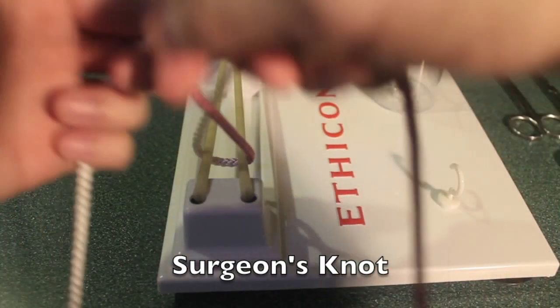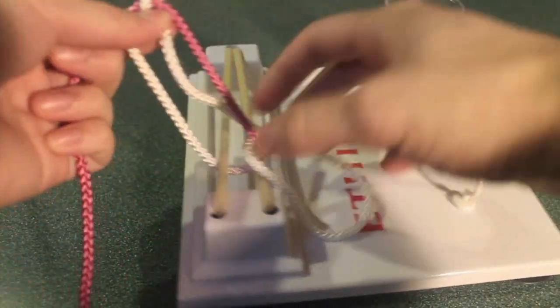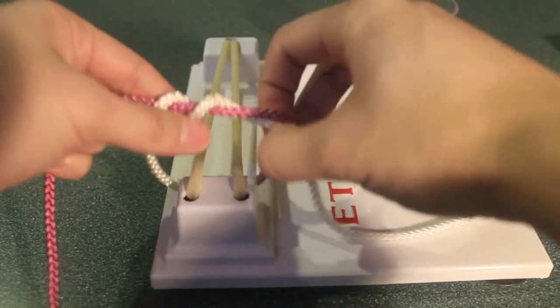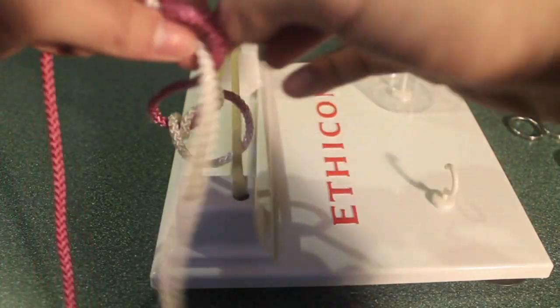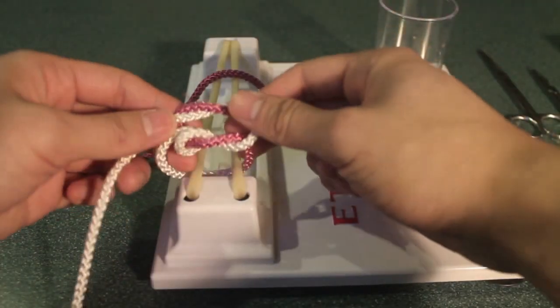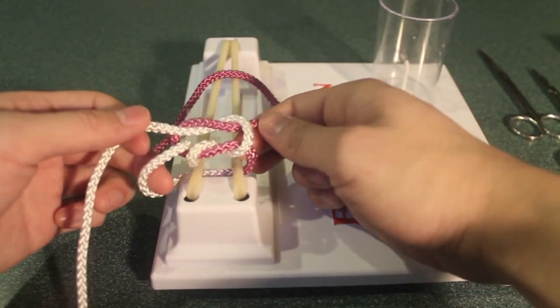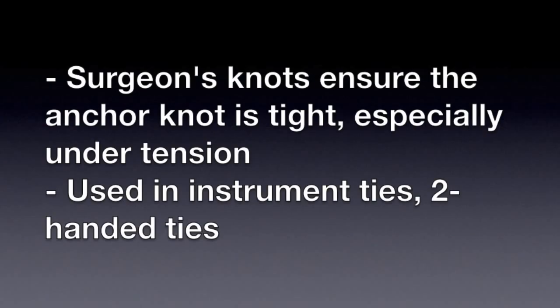The next knot is the surgeon's knot. This is the same as the square knot, except that there's two twists on the bottom, and then one twist on the top. The surgeon's knot is useful to make sure your first knot or your anchor knot is tight, especially when your knot is under tension. This is used in instrument ties as well as two-handed ties.